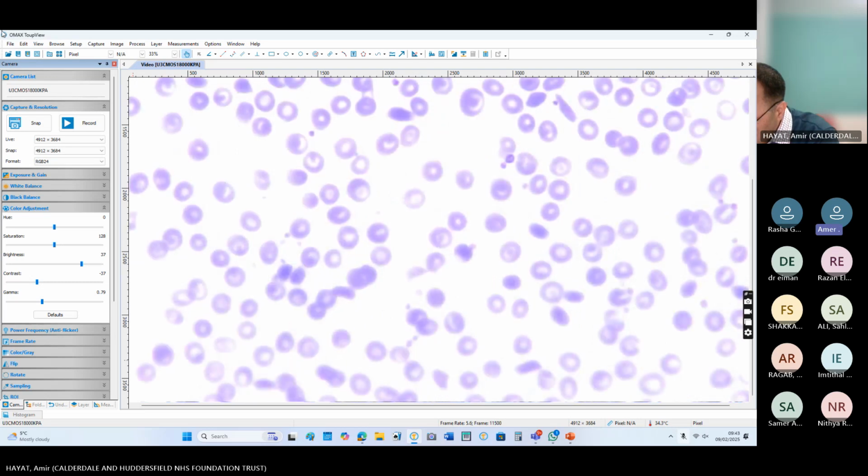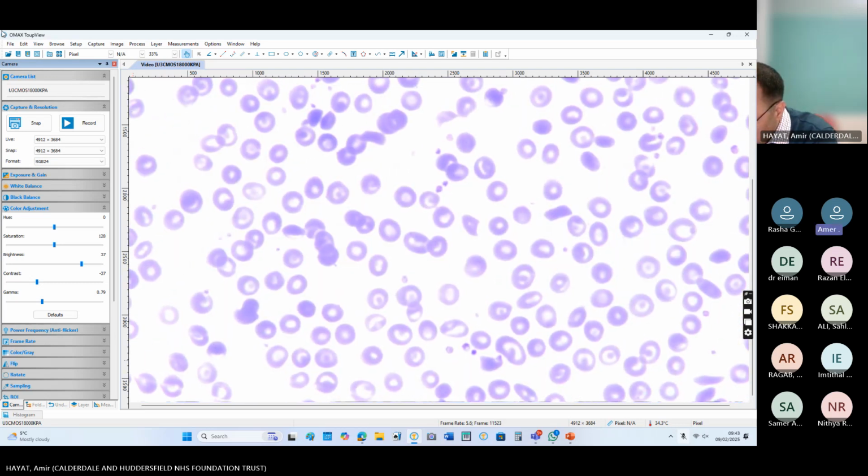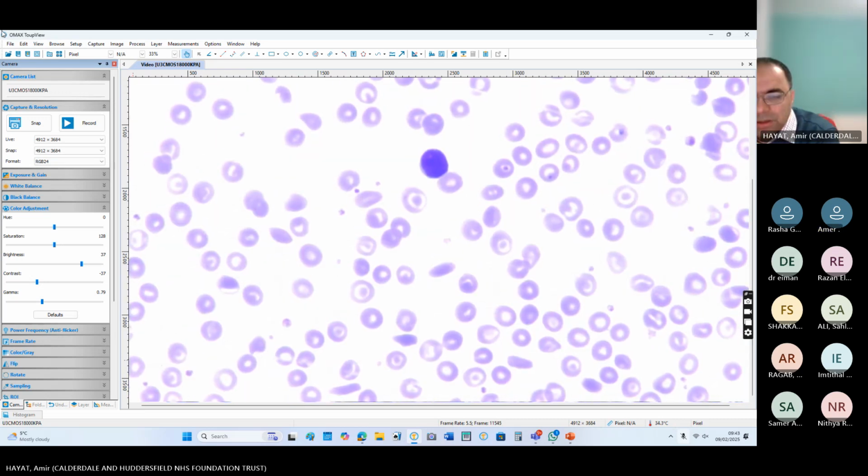This patient has a dual diagnosis. I brought it only for the purpose of hemoglobinopathy, sickle cell. But sickle was target. It means something, SC hemoglobin maybe.